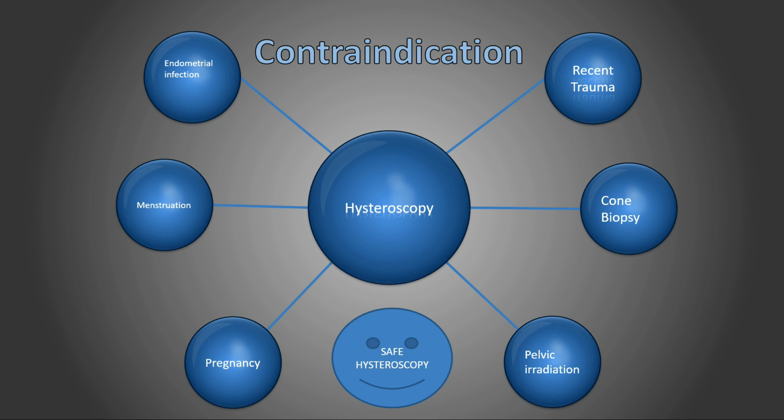You have not done the MTP, somewhere else it was done, and it comes to your mind to see retained products of conception or this and that, you should think twice. Because during that evacuation of pregnancy, if they have traumatized the uterine myometrium, you are going to perforate it. Because it's already half perforated, pressure will increase, will flush, and you will be in trouble.